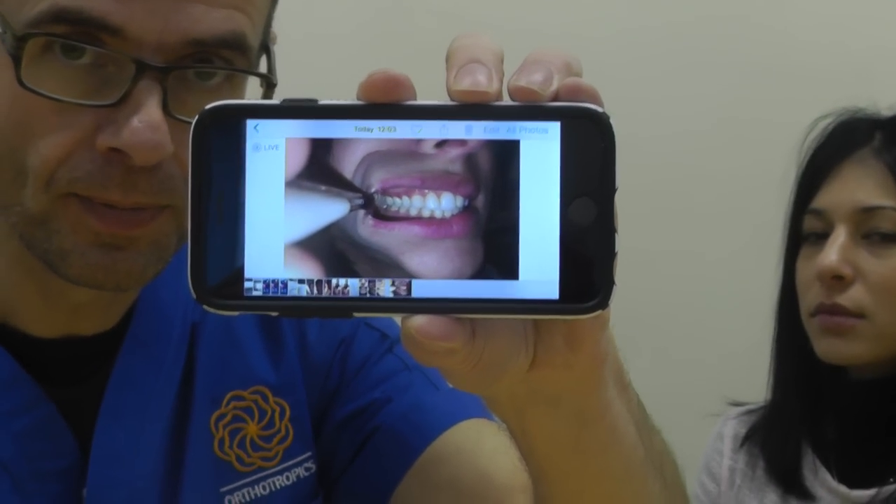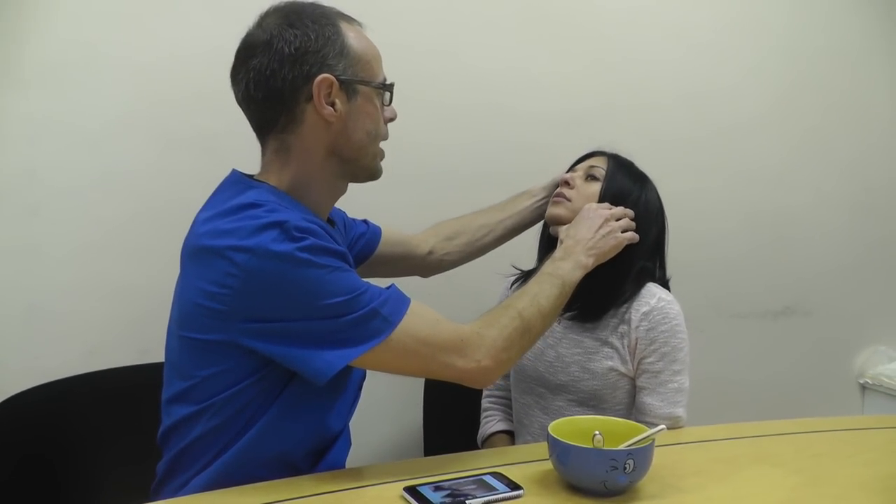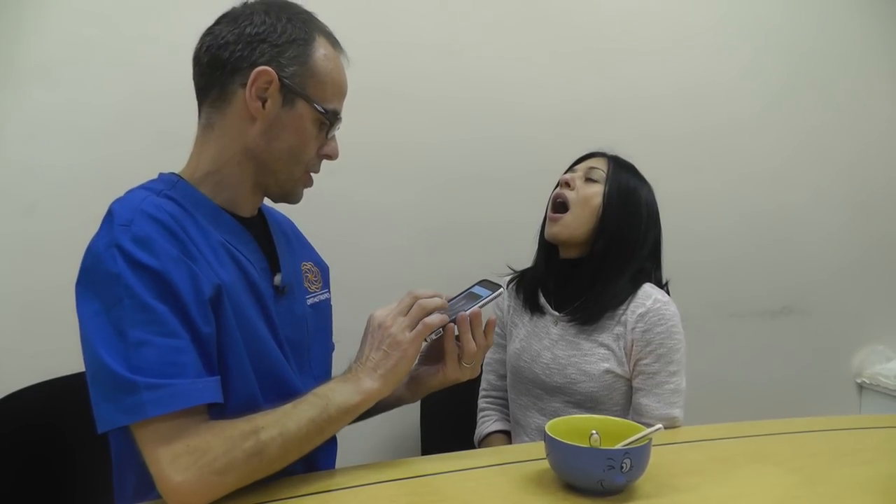I've got this view here. I would do the same thing for the other side — it's just a repetition. Now, if we lean our head right the way back like that, open nice and wide, go back to the camera, and then we might use two fingers for this, rather than — wash your fingers before we started.